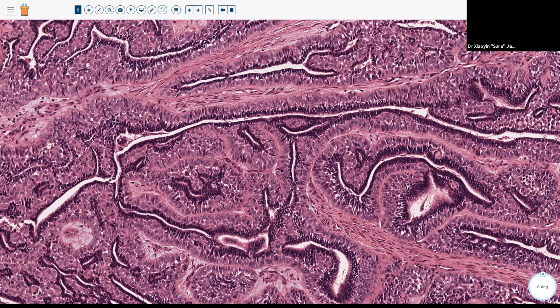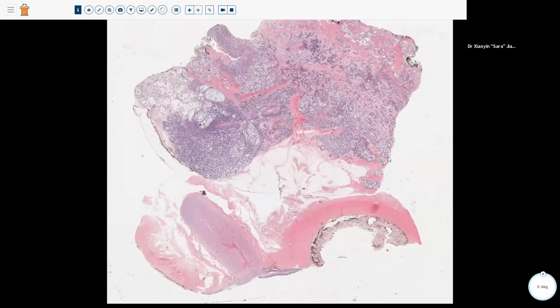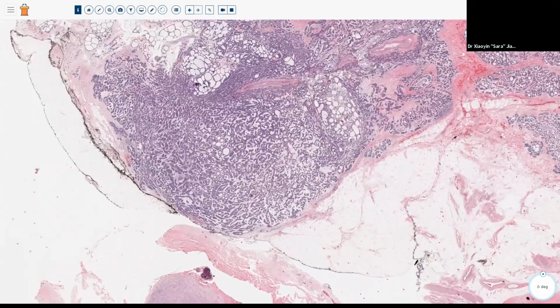Right, so a case of epithelial myoepithelial carcinoma. All right, so another case where the low power is very striking. We have a proliferation of cells here sitting next to a big nerve and a vessel, and the tumor is not particularly well circumscribed. We can see little islands of tumor kind of percolating out into the fat, getting close to that vessel. All right, so let's step in a little bit and see what is making up this tumor.